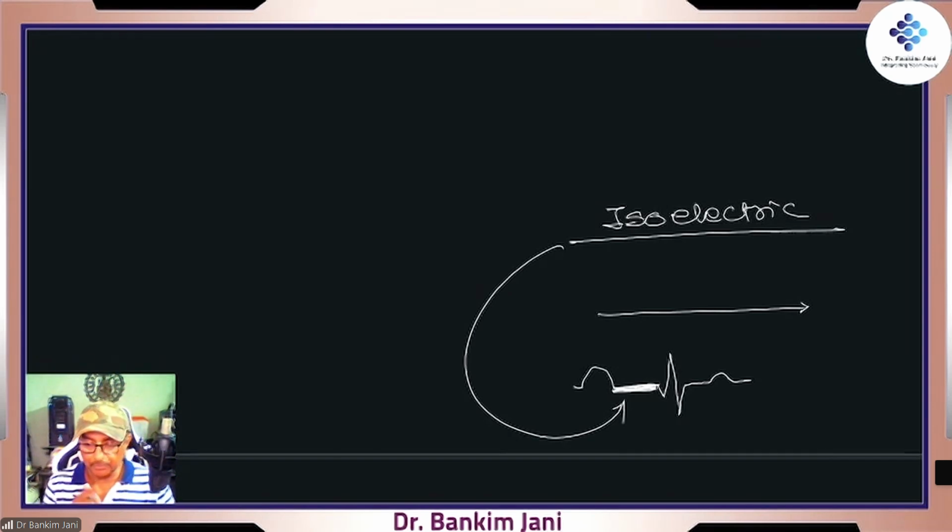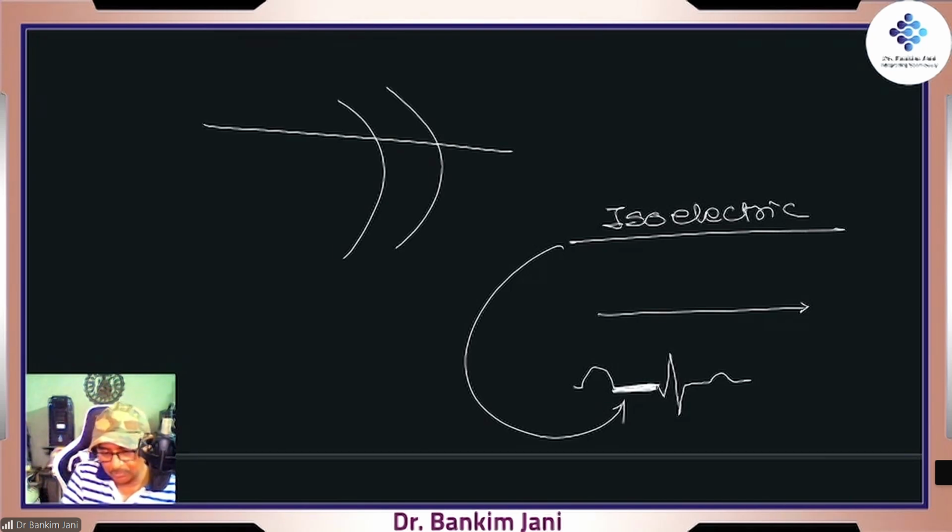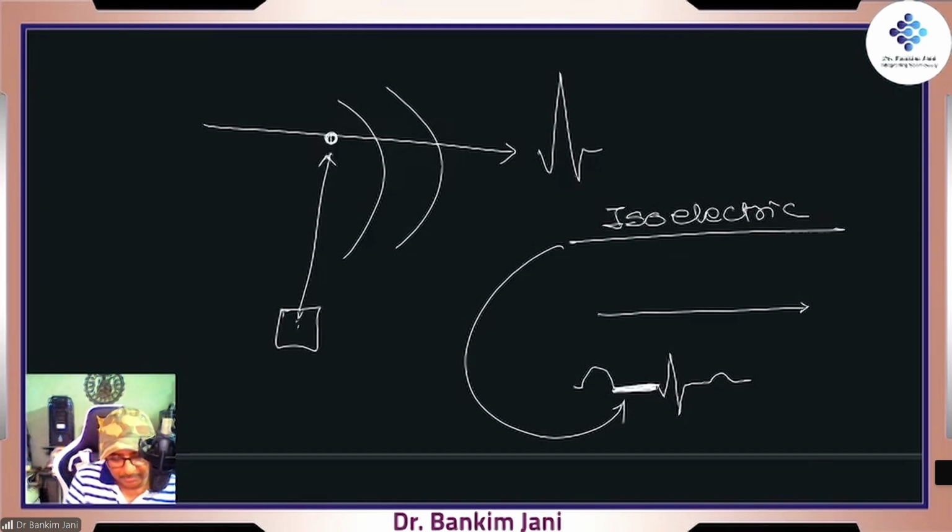Another thing you have to watch at times. Tell me how things would go when there is hypertrophy. Right? When there is hypertrophy, over here it would be a big wave. But if someone is watching this entire event from here, then what will he see? That yes, the signal is coming, and then the signal is going.